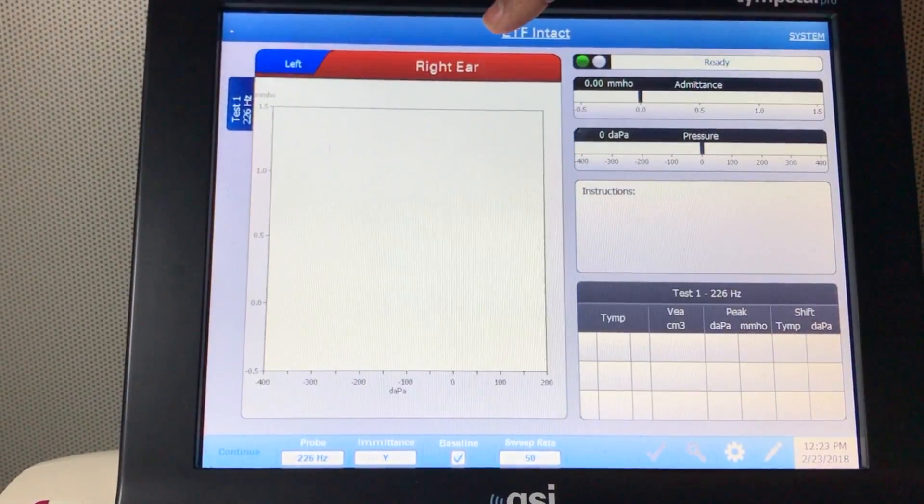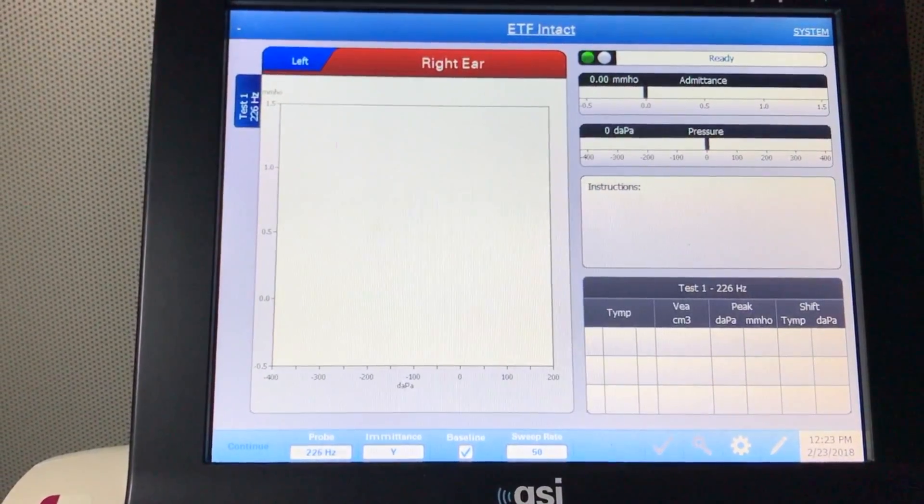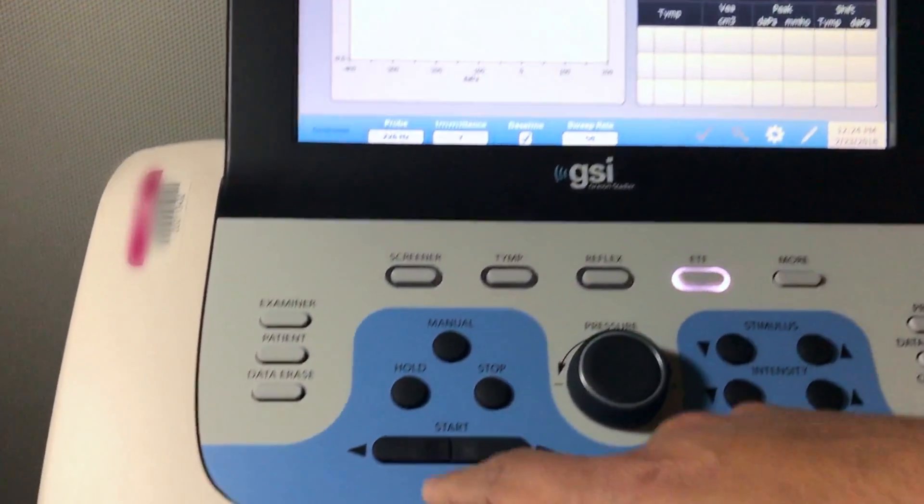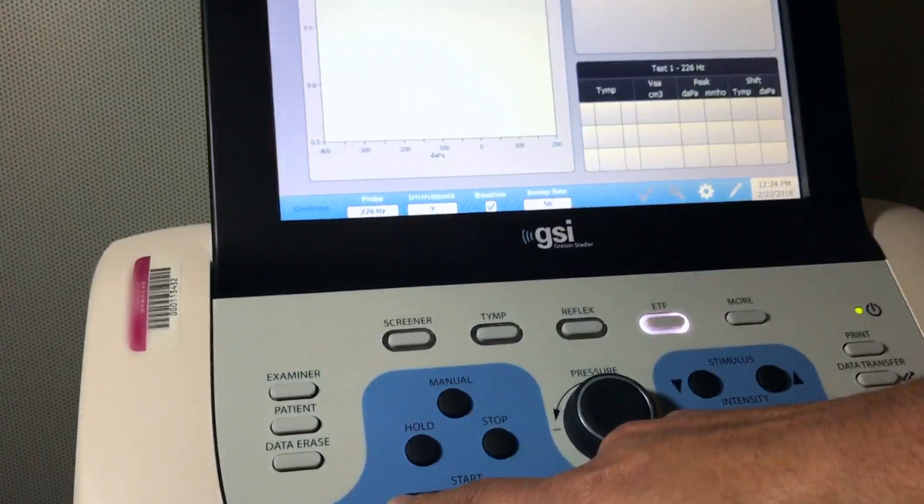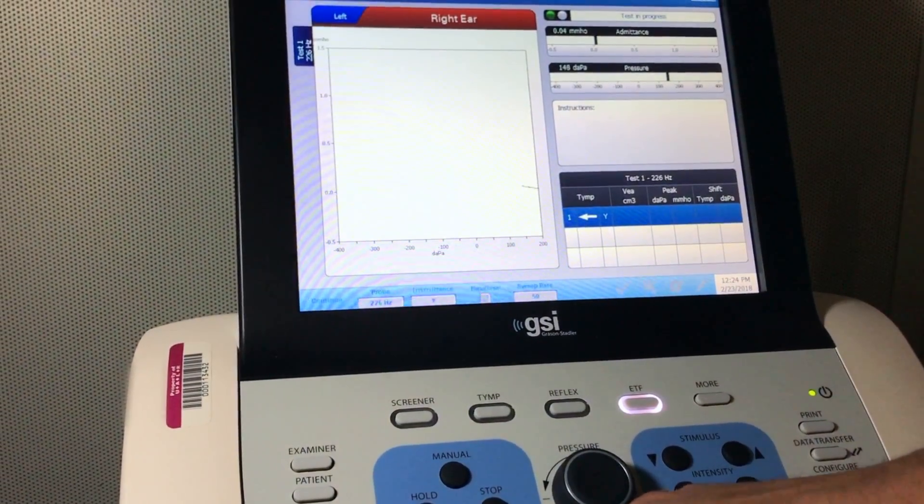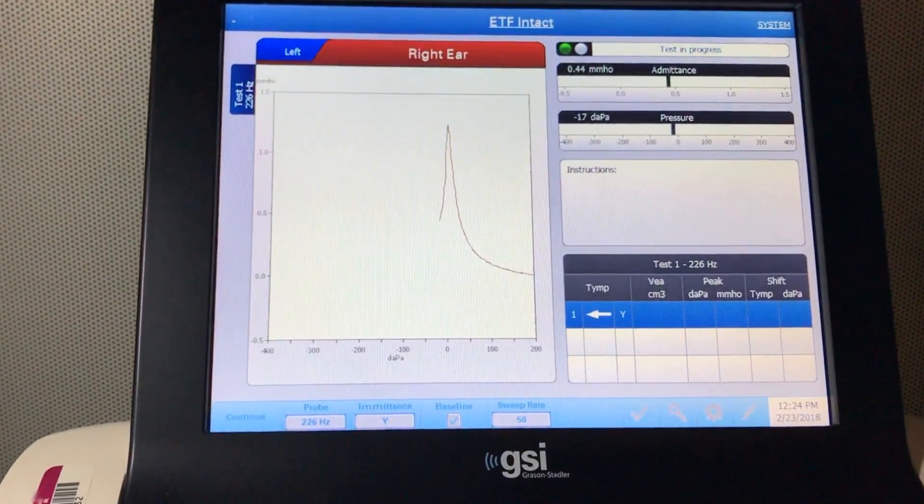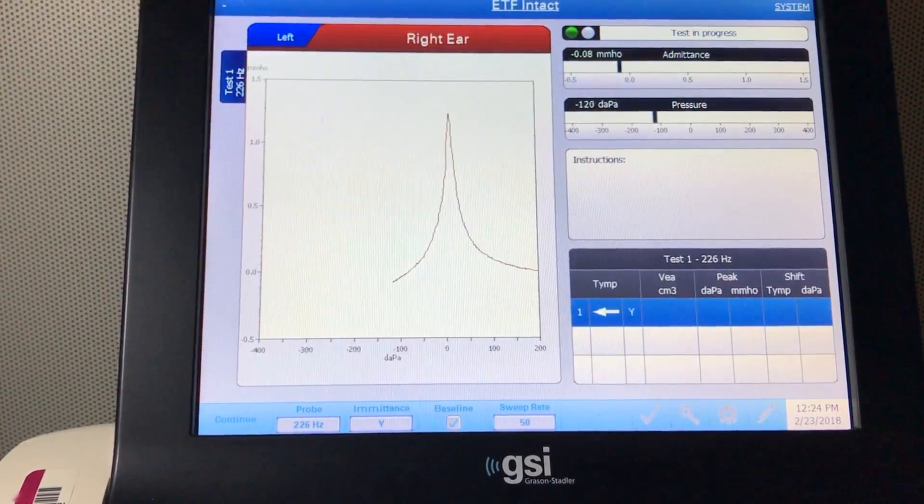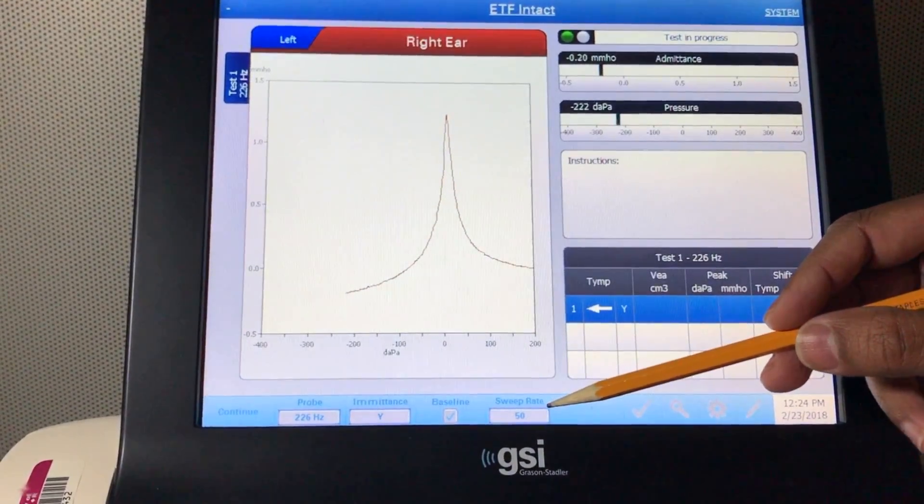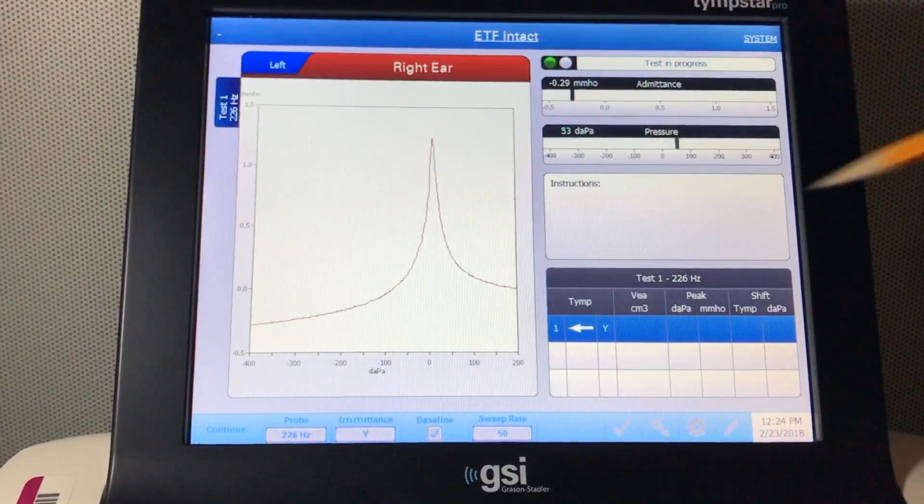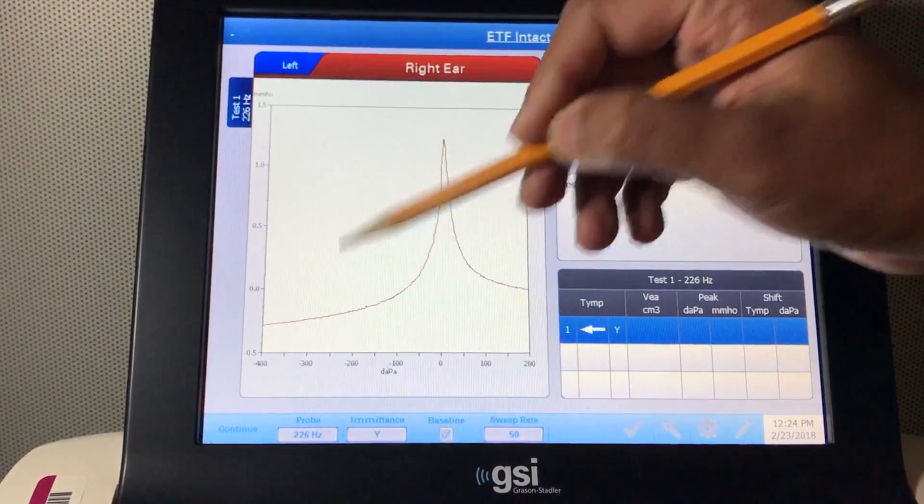We're going to be performing on the right ear. So first you need to get a baseline tympanogram. All you need to do is press start here. So we're getting a baseline tympanogram. We have already placed the probe in the ear, and as you can note here, the sweep rate is 50 decapascal per second, which is slow but it's supposed to be good to get a good tympanogram.